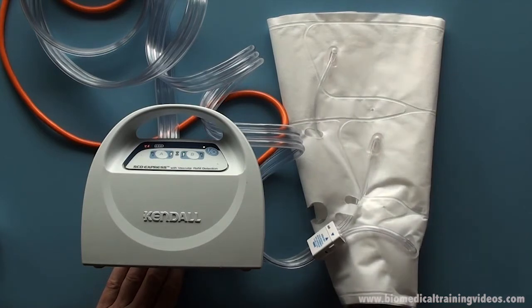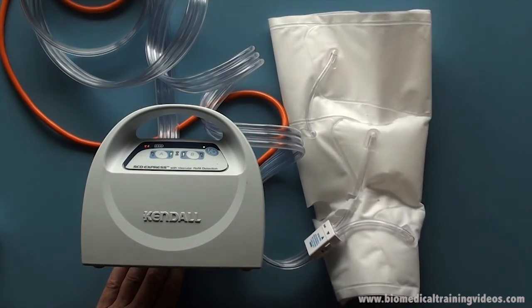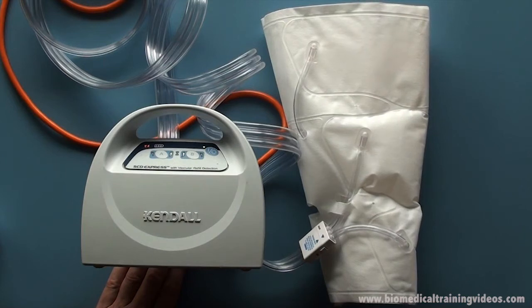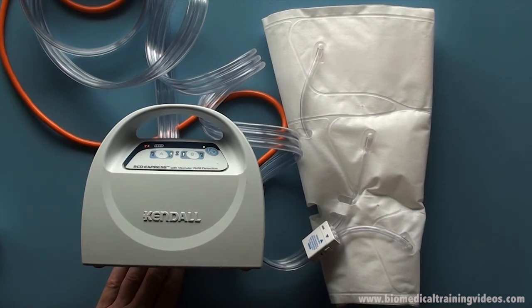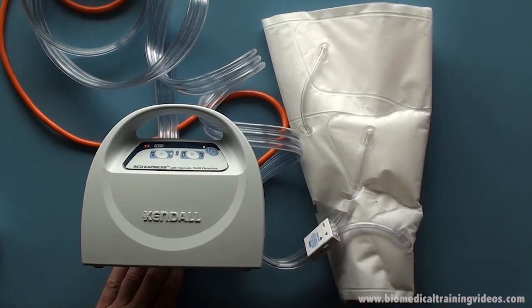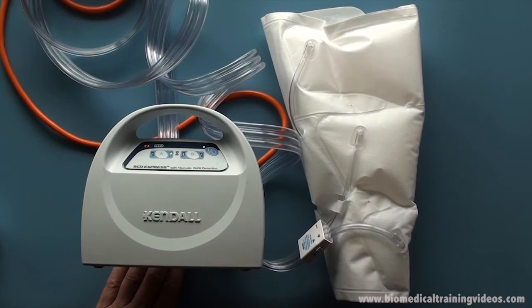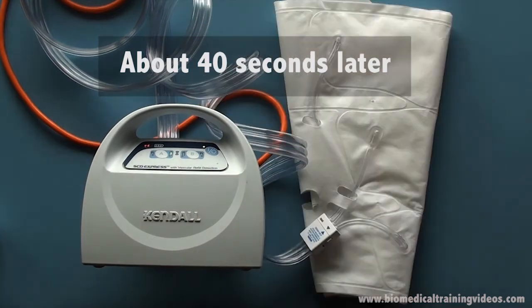Now just showing the inflation cycling. It starts off at the ankle, then the knee, then the thigh, and repeats in a waveform-like cycle. The idea here is to push the blood in the leg. About 40 seconds later this cycle repeats.